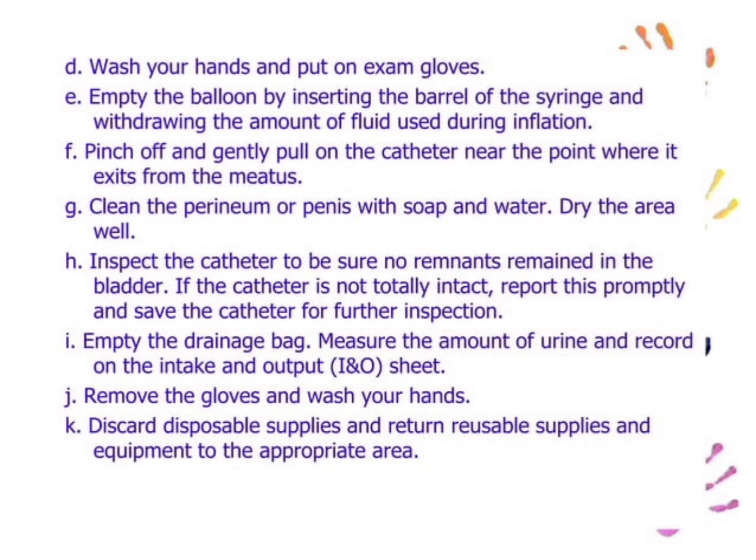Wash your hands and put on gloves. Empty the balloon by inserting the barrel of the syringe and withdrawing the amount of fluid used during inflation. Pinch and gently pull the catheter near the point where it exits from the meatus. Clean the perineum or penis with soap and water. Dry the area well.